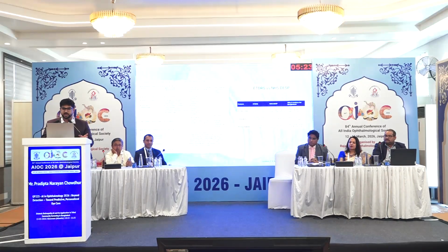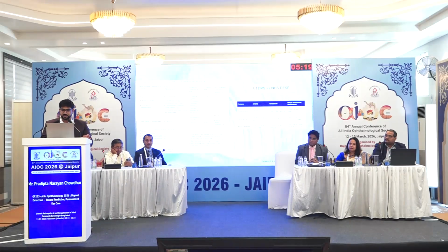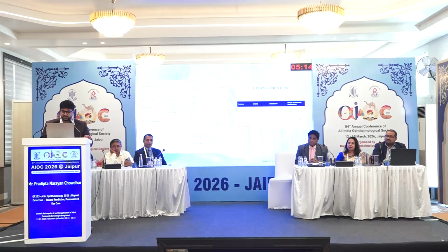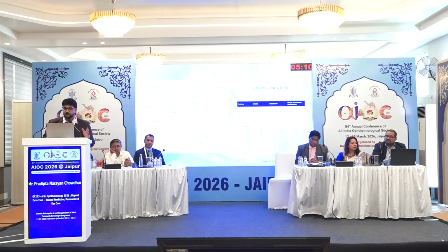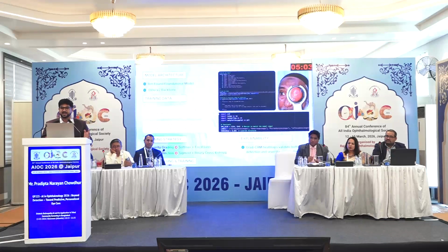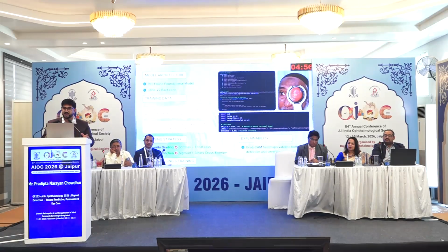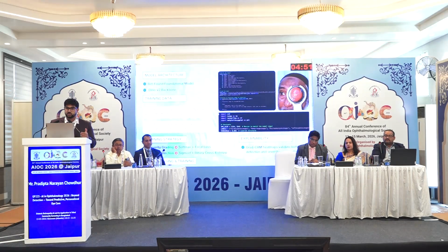So why did we do that? Because the UK National Health Service has one of the biggest diabetic eye screening programs across the whole country. It's amazing for faster triage, and it also needs fewer photos for detection. So instead of ETDRS, we decided to use the NHS DESP grading. Now I'll break my presentation into three small parts. First, the model architecture, then the workflow, and finally the challenges we faced when we implemented it in the tribal communities.